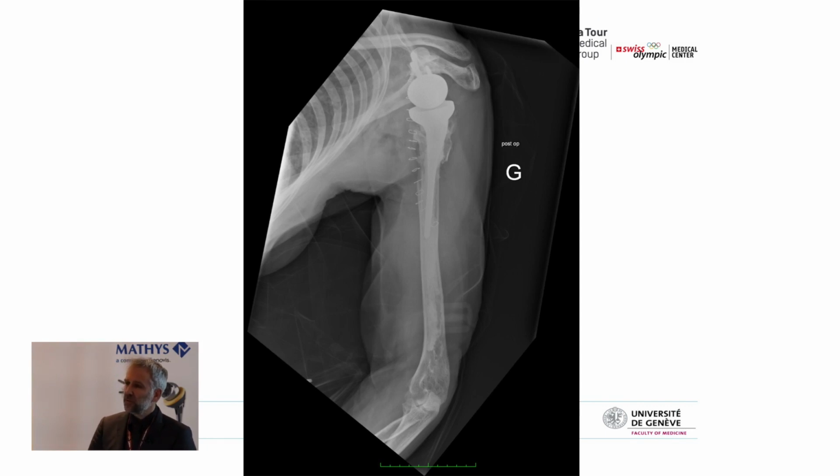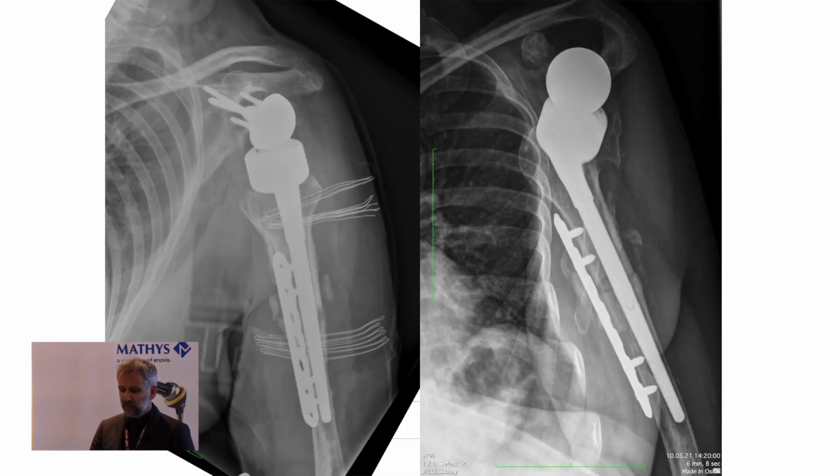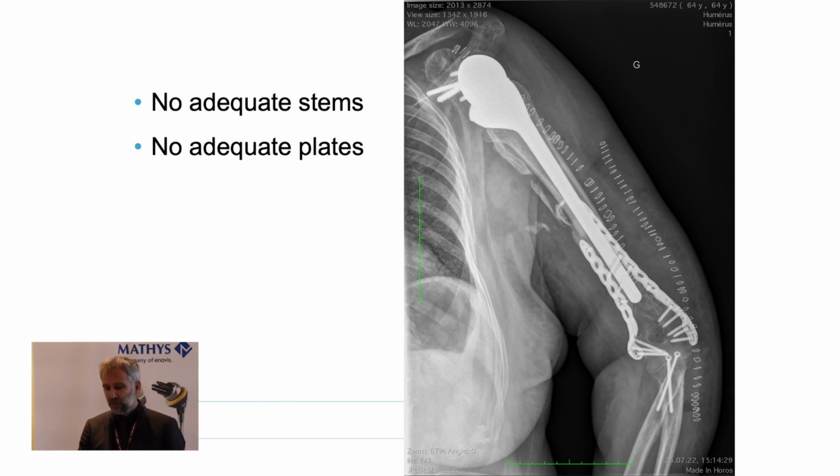2018, and she came back in 2020 with this. So still a lot of cement distally. So I did a revision, and I used this device. So long stem, APC, plate, and I was quite happy with what I did. It's not perfect, but I was, however, quite happy. And she came back in 2022. So I did this in 2020, and she came back in 2022. So fatigue fracture distally, disassembly, because you need to have a monoblock for these difficult cases, and no more APC. So what to do? I don't have time to show you the revision, but I just would like to share this postoperative X-ray.